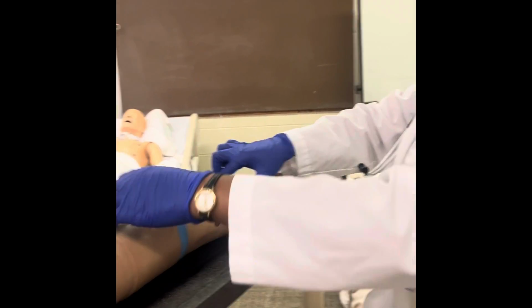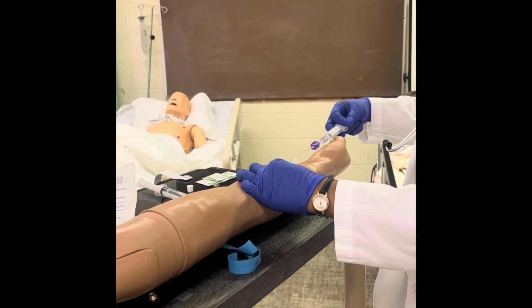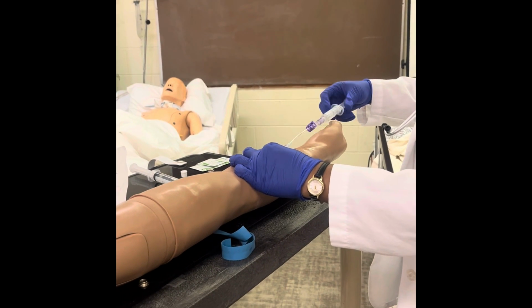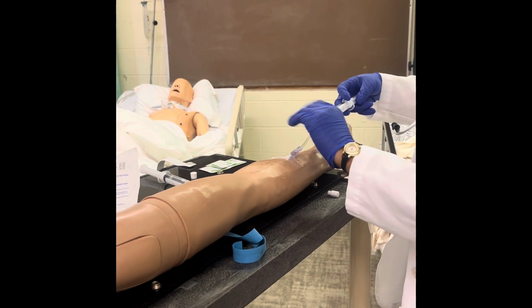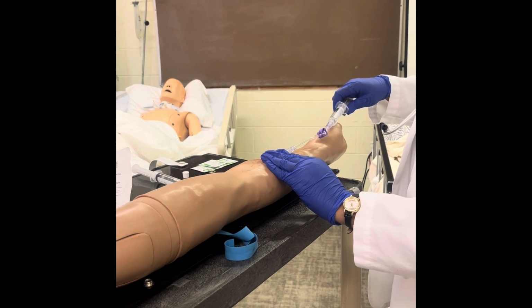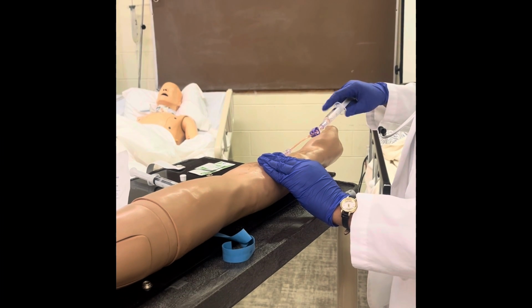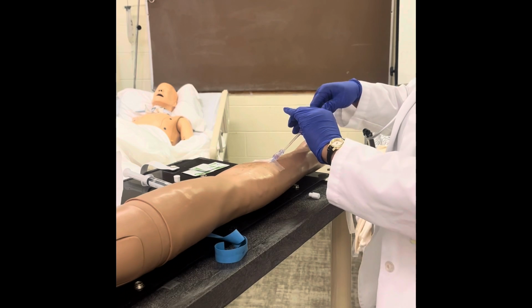Release my tourniquet. And then I can flush the tube in. Unclamp it, flush the tubing. And just to make sure it's in the right spot, I can also pull back a little bit to make sure I'm getting blood return, which I am. Okay.